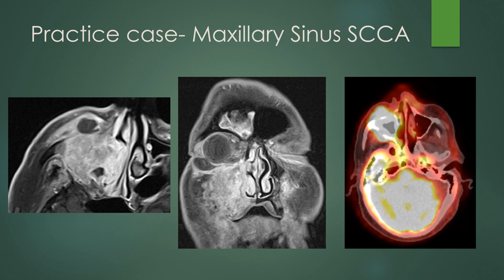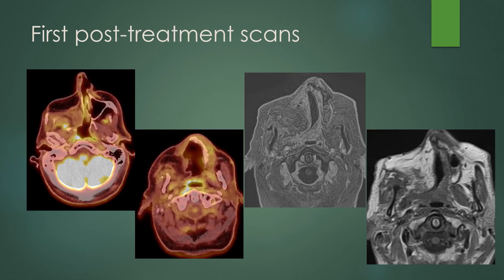For a practice case: a maxillary sinus squamous cell carcinoma — a large invasive mass involving the maxillary sinus, extending into the nasal cavity, invading into the pterygopalatine fossa, pre-maxillary soft tissues, and floor of the orbit. Massive uptake on FDG PET. On the first post-treatment scan, the flap is in place with architectural distortion from the maxillectomy. Posterior to the flap, there's an area of FDG uptake, but nothing mass-like.